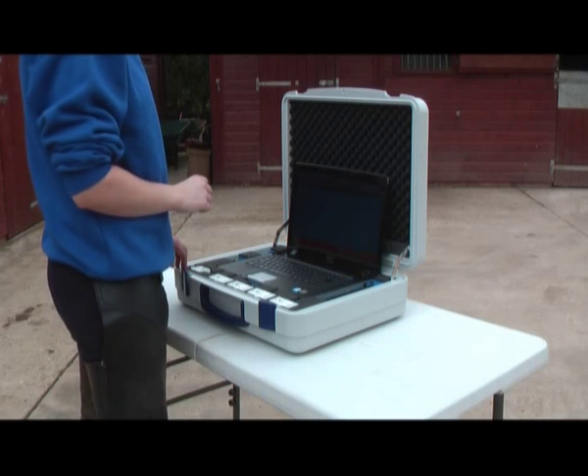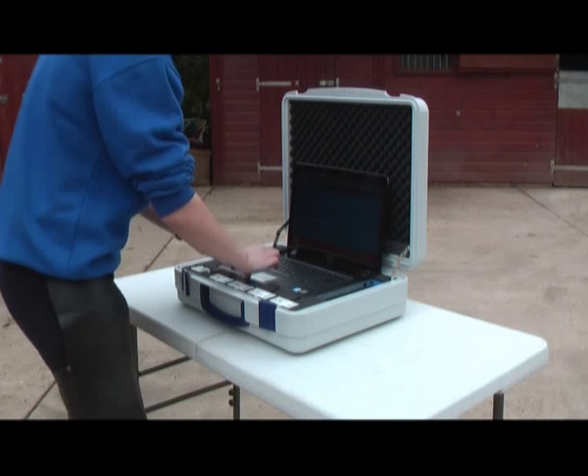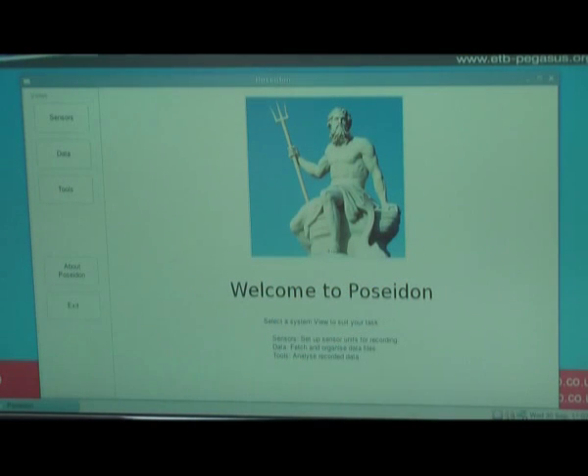Once the GPS sensor has found its location and I attach it to the laptop, I then go into Poseidon. Once in Poseidon, the option you need to choose when setting up your sensors is the sensors tab. Once in here, the first thing we need to do is set clocks to Pegasus S, because that's our GPS unit.